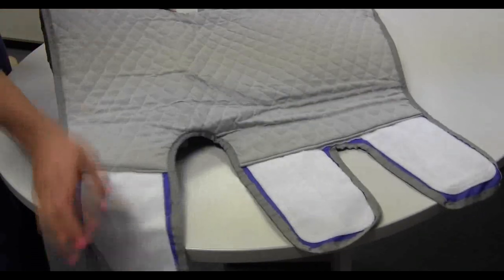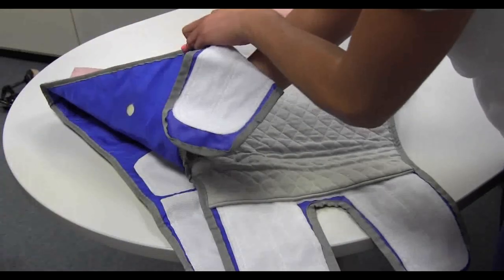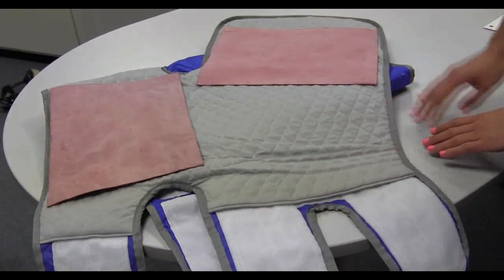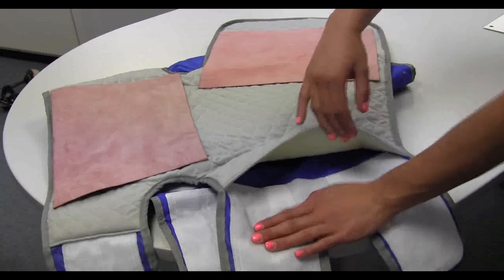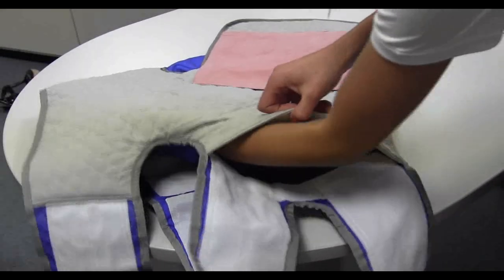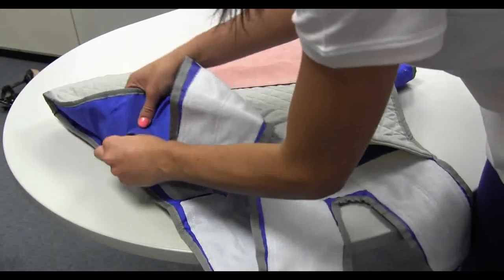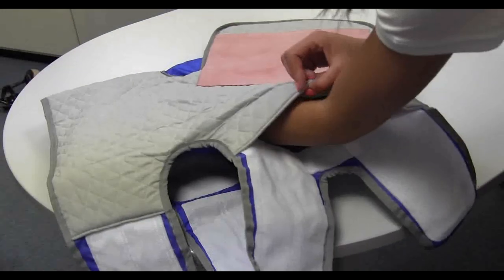Repeat these steps on the opposite side of the cuff. Align the upper thigh buttock bladder with the cuff across the buttock area. Align the lower thigh bladder lengthwise down the cuff. Open the hook and loop binding, fold the upper thigh buttock bladder over, insert the bladder, and push the bladder inlet through the cuff inlet opening. Flatten the bladder.